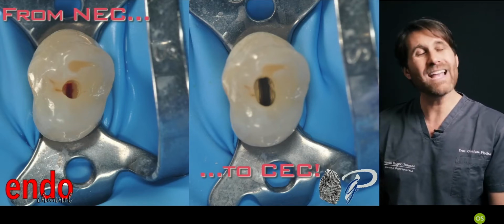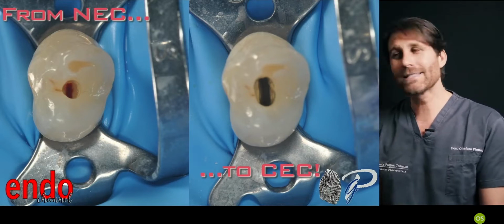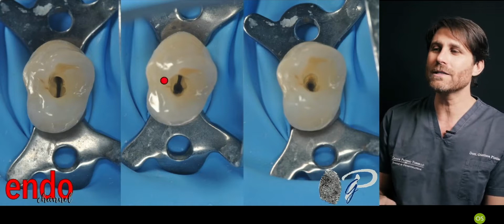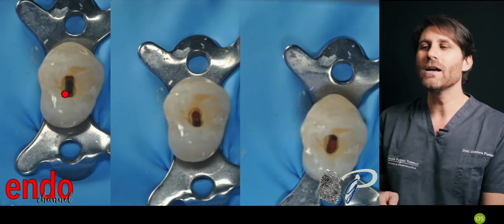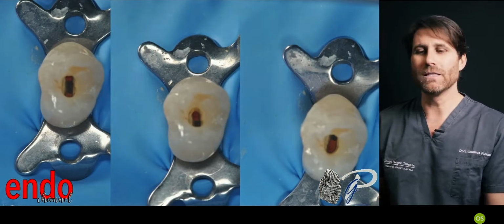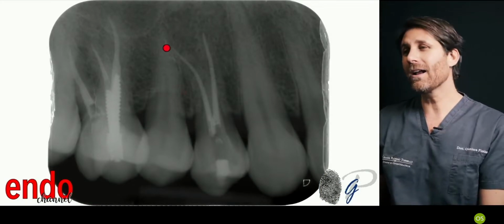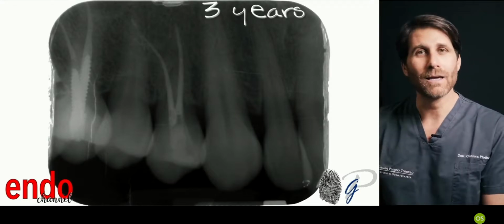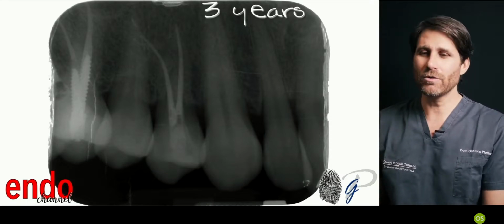We can maintain the same fracture resistance while opening this access cavity a little bit more with a conservative approach that permits us to have a look at the different orifices from different projections, to look at the isthmus and to clean everything, to fill three-dimensionally all these spaces and to perform this kind of endodontic treatment in these difficult canals, very strict, very curved, with this coronal conservative approach, maintaining the tooth structure, making the coronal restoration following this treatment much easier, increasing the fracture strength of the tooth.